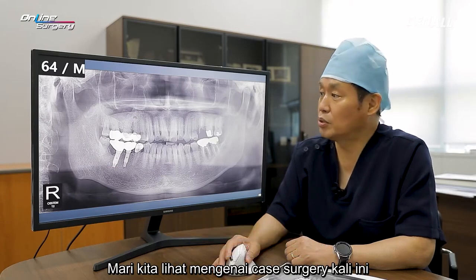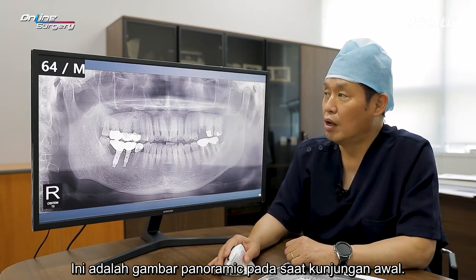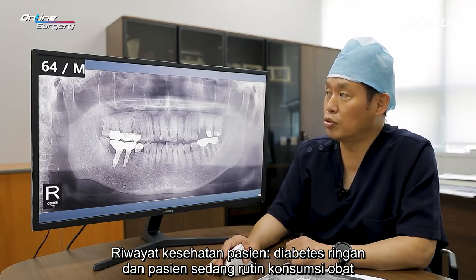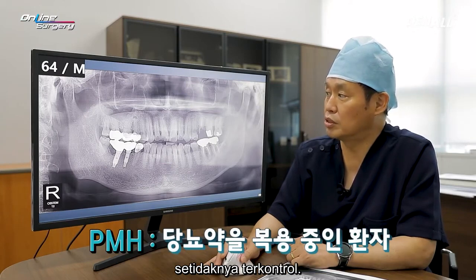Let's look at today's surgery. The patient is a 64-year-old male. This is the panoramic image at the initial visit. The patient's medical history: the patient is slightly diabetic and was taking oral medication, and it was comparatively well controlled.